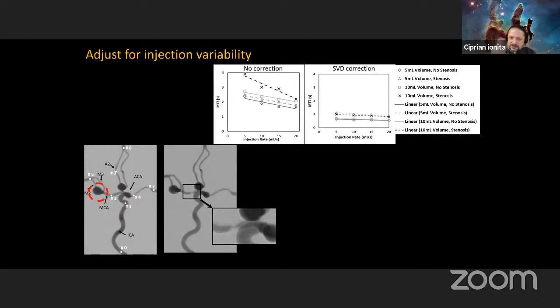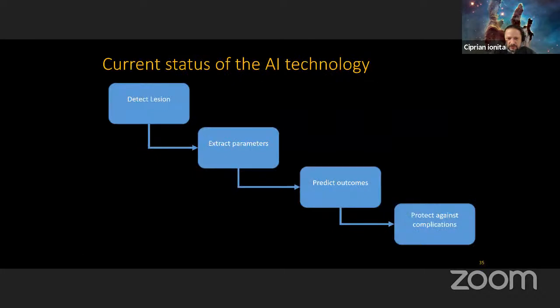And if we add the C-arm changes into play, then it's going to be an even bigger problem. When we have these variabilities or inconsistencies in the acquisition, we are not able to do our job properly. So what we're going to do is go back and start looking into things like AI or data-driven models to help us overcome this variability and patient variability by looking at lots and lots of data in order to solve the problem.